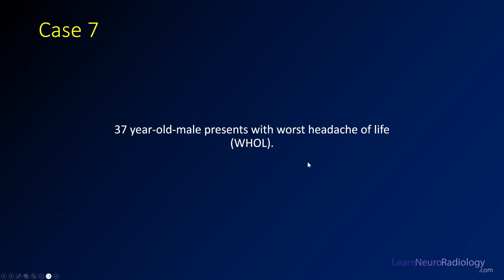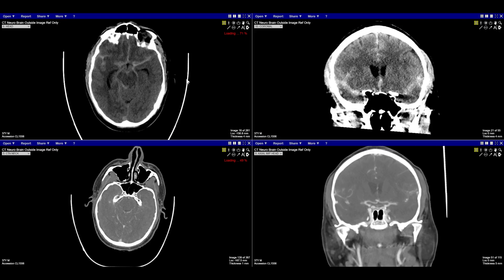Case seven is a 37-year-old man presenting with the worst headache of his life. If you've taken Step 1 or any of the USMLEs, you might recognize this history. Here we have some images from our case. In the top left, we have a non-contrast head CT, the axial images. Top right, we have some coronal images from that same non-contrast head CT. The bottom left, we have a CTA, a CT angiogram, that's going to help us figure out what's going on. And here we have some coronal images from the CT angiogram.